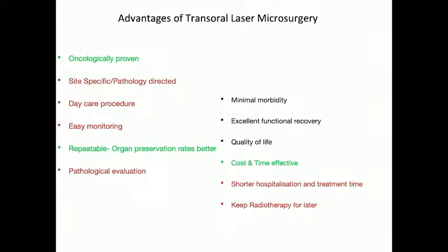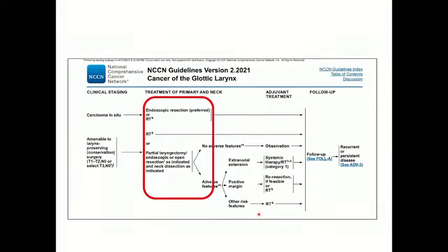And more importantly, nowadays you have beautiful endoscopy systems across all clinics. Small clinics have a beautiful Hopkins scope. You can easily follow up these lesions. You don't need a PET scan. So most of our patients come and ask me, sir, PET scan should we do, right? With a simple Hopkins evaluation, there's no need to do a PET scan in those situations.